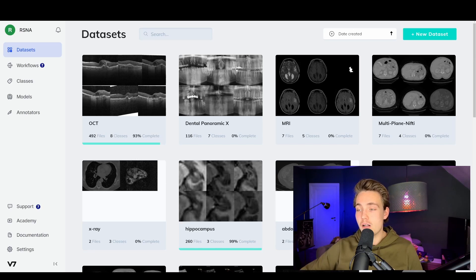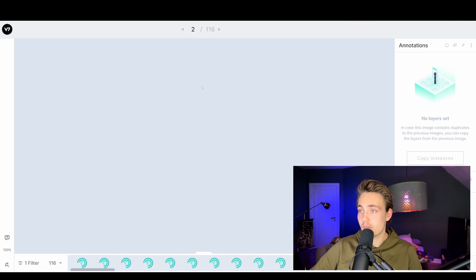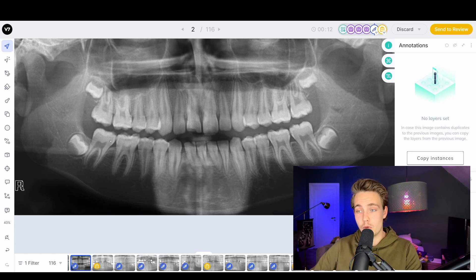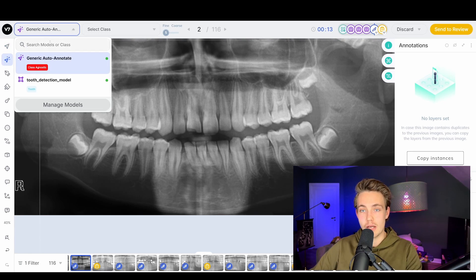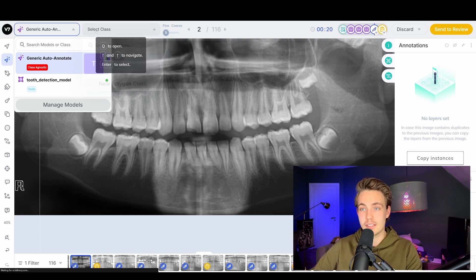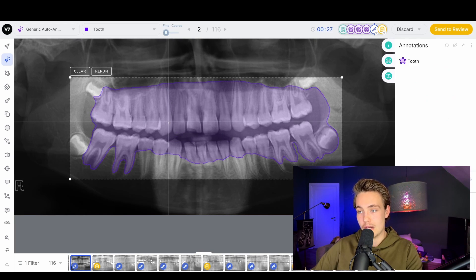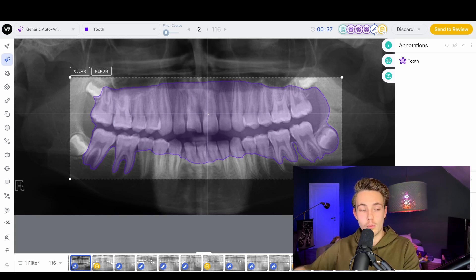Now that we've done our annotations on our DICOM files, I also want to show you how we can do it on dental panoramic x-ray images. We go inside this dataset and choose a sample. Here we can see we already have an annotation - I'm going to delete that. We want to segment out these teeth in this x-ray image. We can go up to auto annotate - we have a generic auto annotate model and an object detection model, but I actually want to show a semantic segmentation model for the tooth. Drawing a boundary box around the teeth, we get results but it's segmenting out everything - we actually just want each individual tooth segmented out.